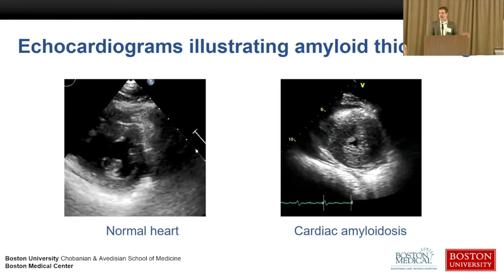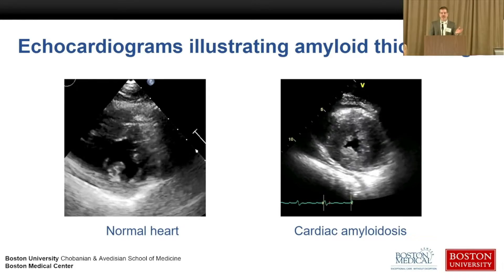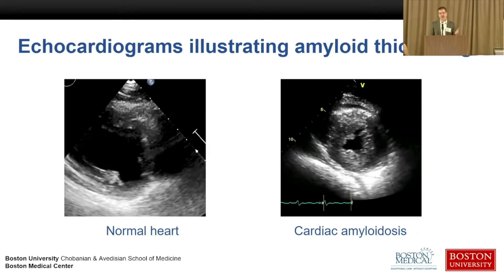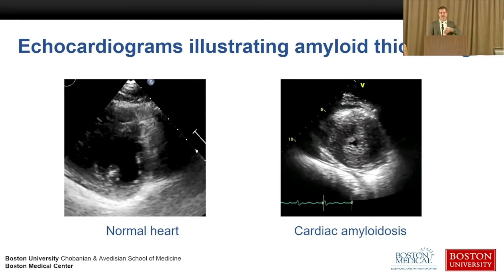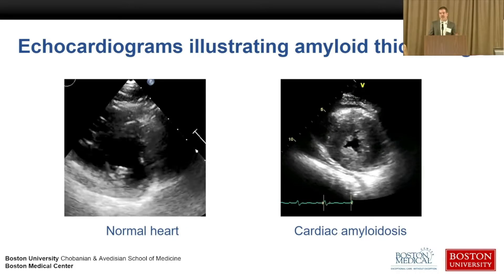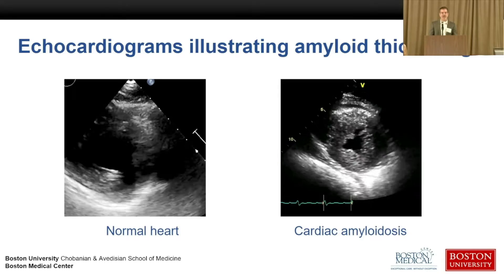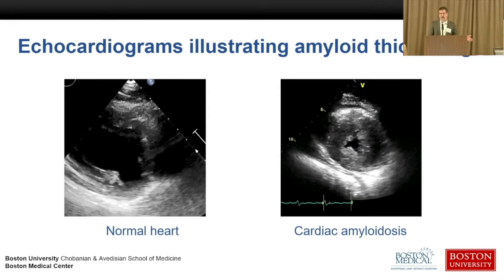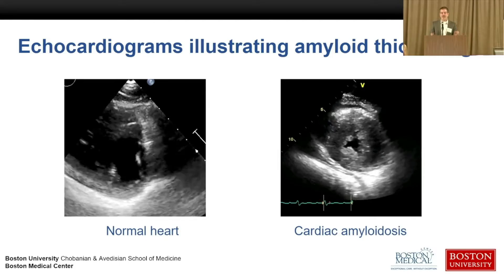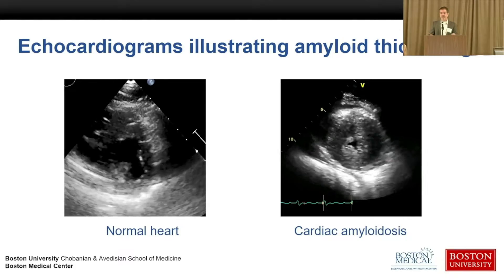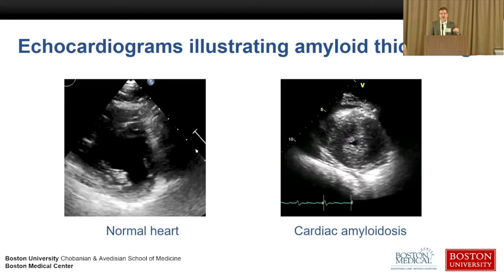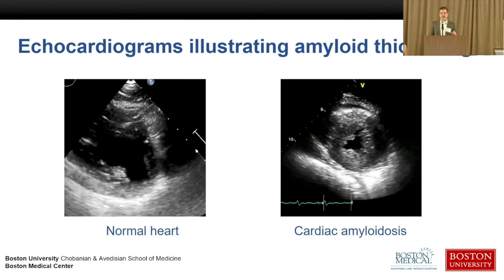These are two echocardiograms showing a normal heart on the left and a cardiac amyloidosis heart on the right. This is cardiac ultrasound — the same kind of ultrasound used during pregnancy. The ultrasound beams bounce into the body and off tissues to create a moving picture. You don't need to be a doctor to appreciate that the amyloid heart is thicker. Notably, both hearts are squeezing normally, illustrating that you can have significant impairment with a normal ejection fraction.